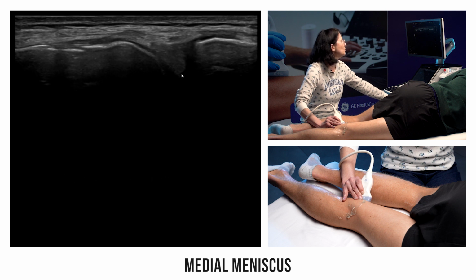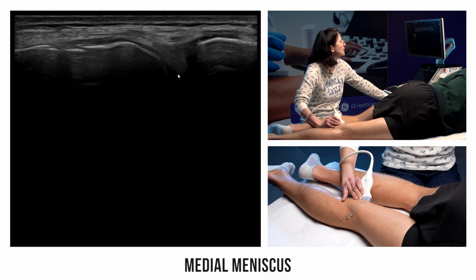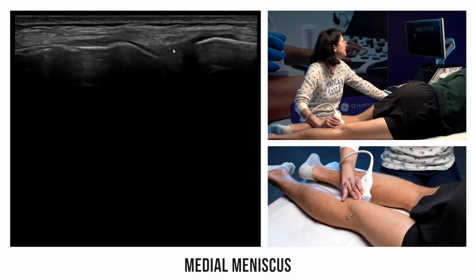I'd like to remind you that the free end of the meniscus is deep and can never be fully examined using ultrasound. Any suspected meniscal tear must always be confirmed with an MRI. Nevertheless, you can see here that the periphery of the meniscus is clearly visible.